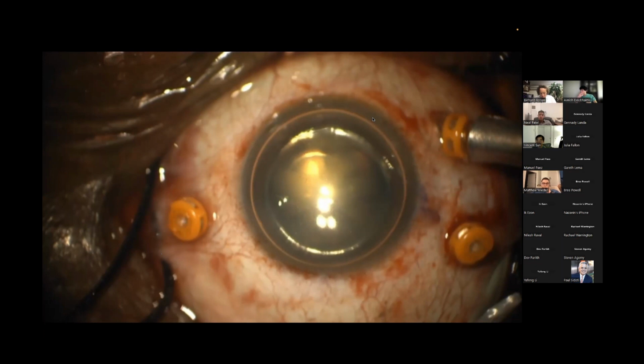I don't like to do cataract surgery when you have a silicone oil filled eye, but we do, especially with patients with uveitis or patients that needed long-term tamponade. But you can take the oil out, you can do the cataract, and those patients actually do well. If you wait like 10 days, they'll do well.